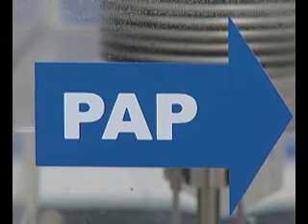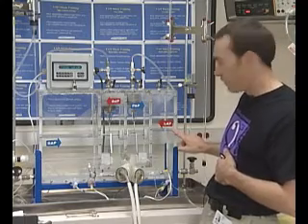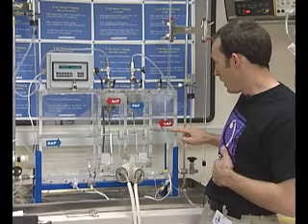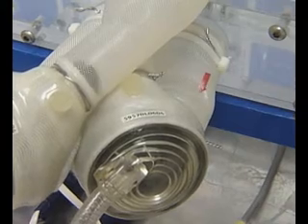And you may not be able to see it, but there's a small tube here, and this small tube would represent the lungs. So the pulmonary artery to the lungs, which then goes into the left atrium, again, which has a pressure, left atrial pressure, which is similar to our body. And that then flows into the device. So we have an inflow to the left side.